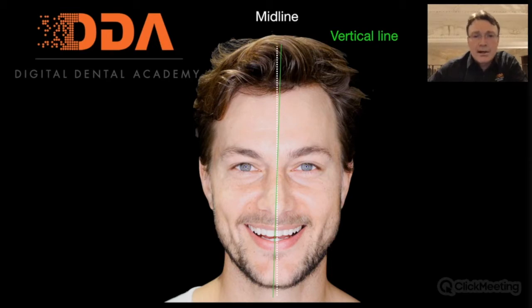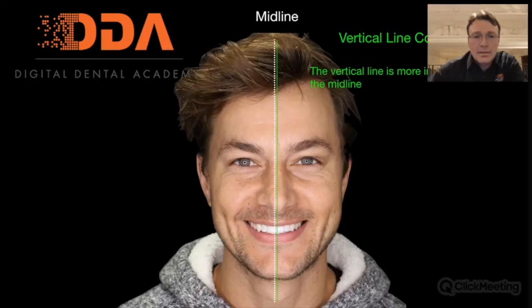So once you've analyzed this vertical line, you know now, for example, that in this case the vertical line is slightly canted. So we're going to need to focus on getting that vertical. And also the midline will not be such a big issue. So this slide shows you the completed case where the vertical line is corrected, but the vertical line of the design is not the midline that we've worked to. But it doesn't matter, you know, for a patient like this, we're talking about a millimeter.